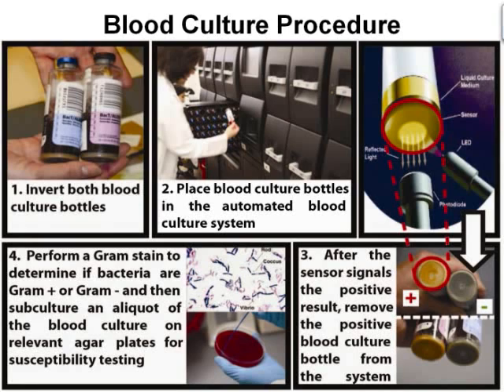At the base of each bottle, there is an indicator which signals microbial growth by indirectly measuring the carbon dioxide production with pH change in the bottle. The pH is read by the color change at the bottom of the bottle. The indicator changes from blue-gray to yellow. Yellow is indicative of a positive result, shown in step 3 here at the bottom right.